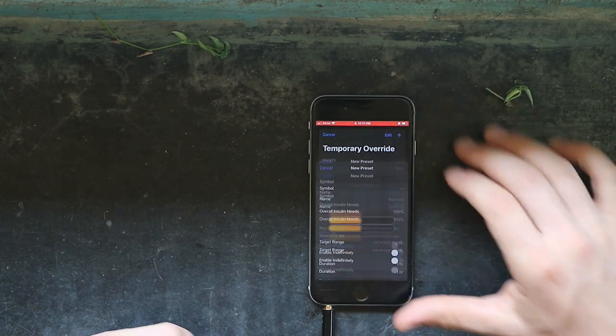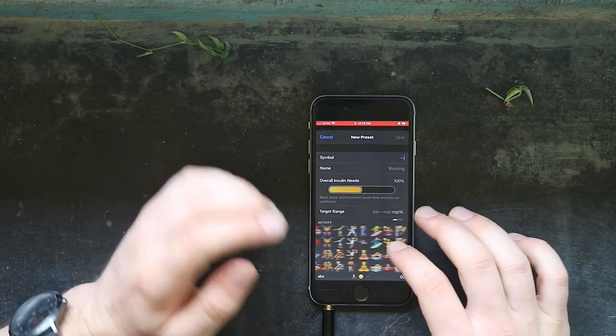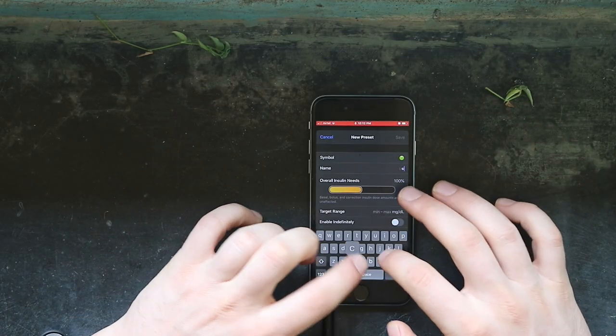Creating a new profile from the beginning, you will see that you can choose your symbol from all the emoticons and set a name. A popular one is for sick days — you can label it whatever you want, but let's call it sick days.